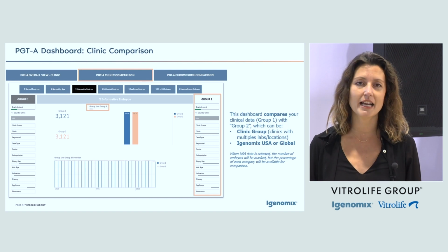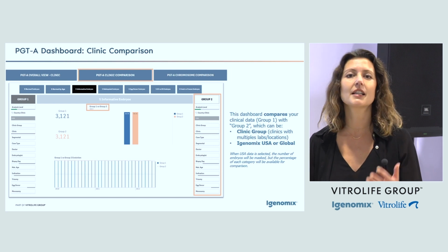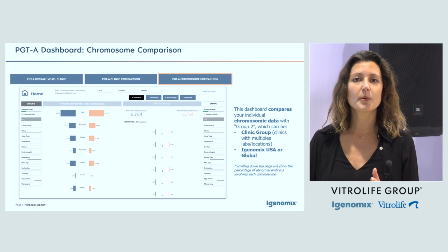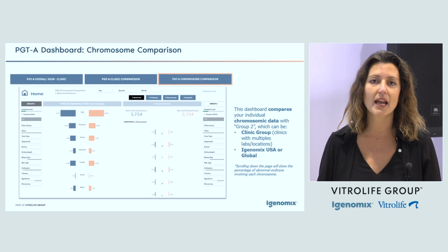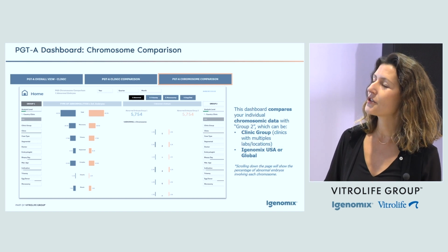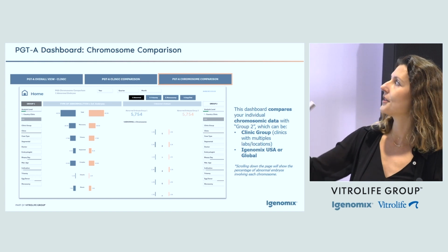And I can tell you that I have clinics that are currently at 99%. That's almost unbeatable. It's almost 100% of the samples that you send are going to have a result. And the last dashboard is also very interesting because everything that is non-euploid or non-normal is going to be considered an abnormal result. But under that umbrella, we have multiple different options. You could have an embryo that is aneuploid or segmental aneuploid or mosaic chaotic, and then you can also have the information for each of the chromosomes. So all that information for that category of abnormal is going to be in the third dashboard.